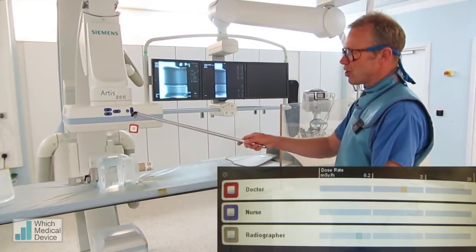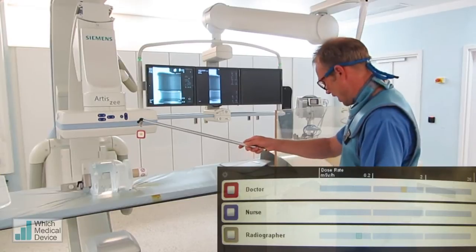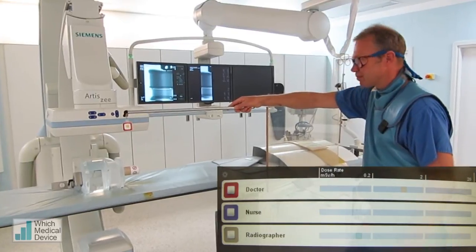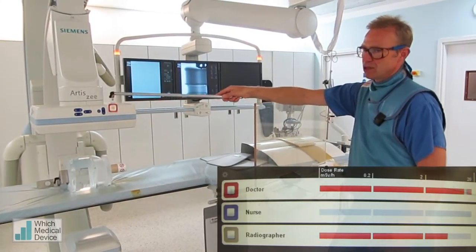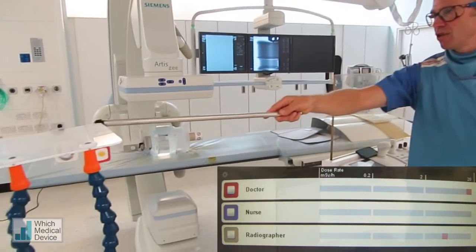That's just screening — that's fluoroscopy. Now if we do an actual digital subtractive run, taking this at 4 frames a second, just watch what happens to the dose here. I'm going to stand behind the screen. And we're right up into the red, both for the metre I'm holding here and also for the metre that's over here, which is a little bit further away.